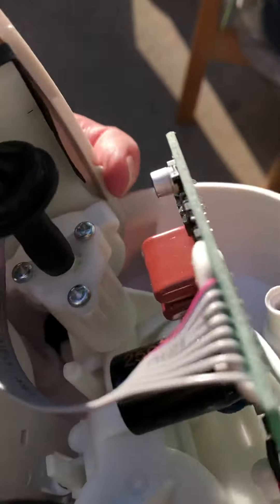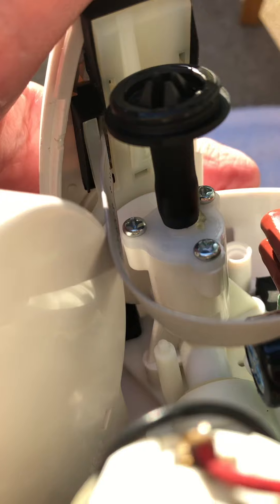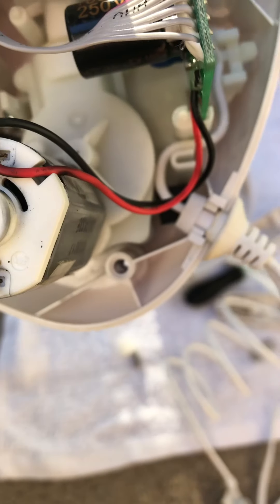There's the little intake valve here, and it looks clean. So, the whole thing has been taken apart.